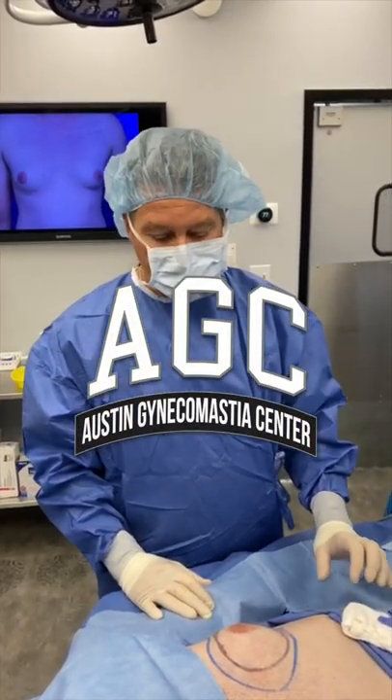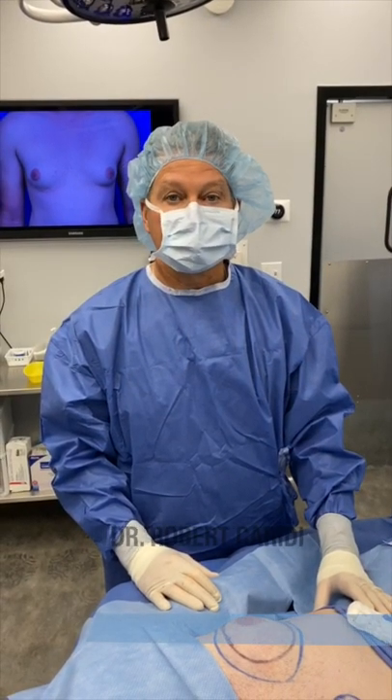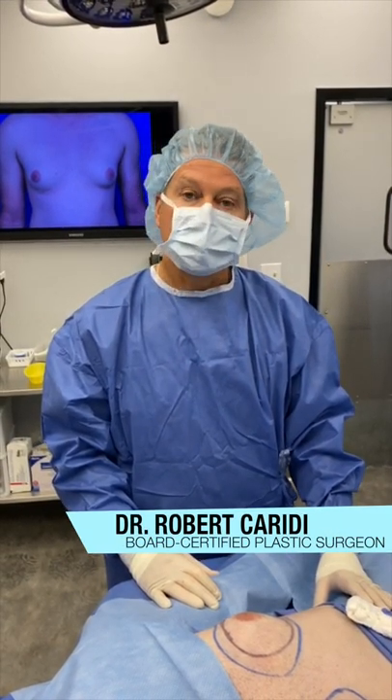Hello, this is Dr. Robert Caridi and I'm going to demonstrate the four-step process that is used for non-skin removal gynecomastia in my paper.